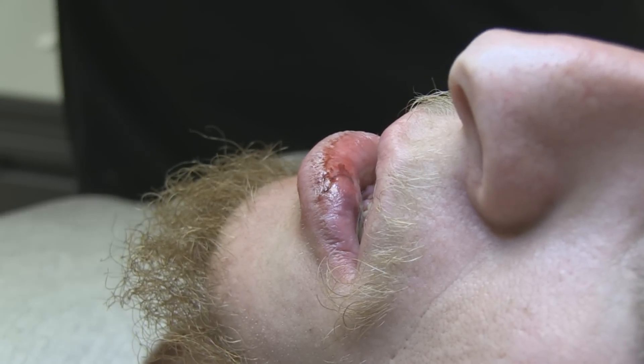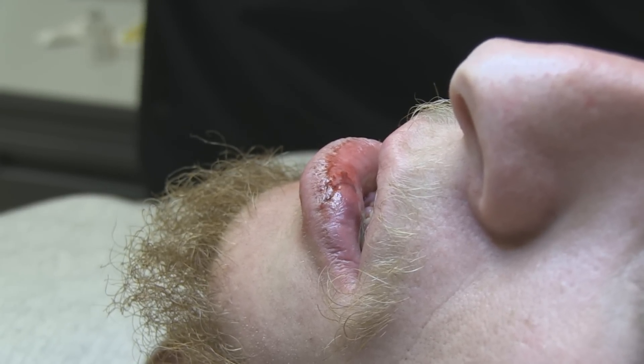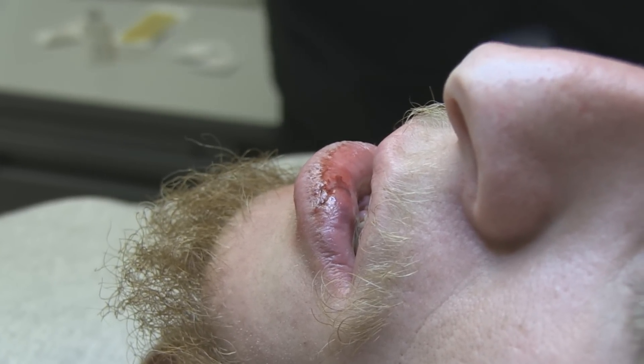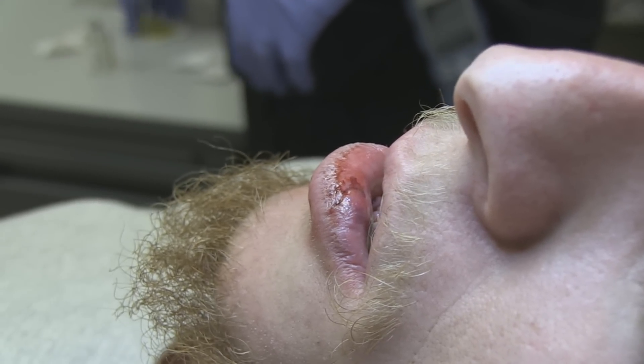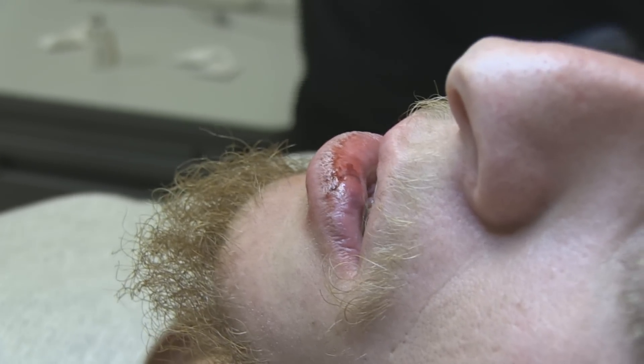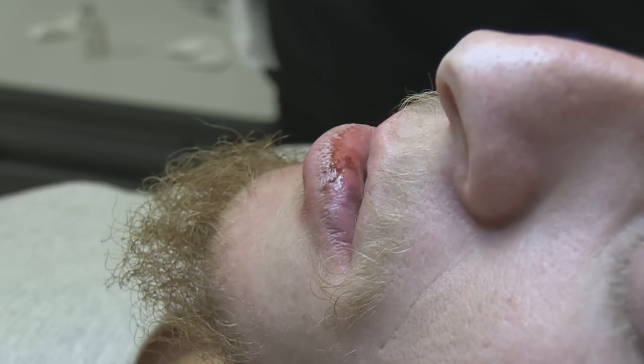And it was lateral enough that we don't need to block the other side as well, so that's actually good for our patient. We'll go ahead and proceed with repairing this. And you don't have any problem if this ends up on YouTube?